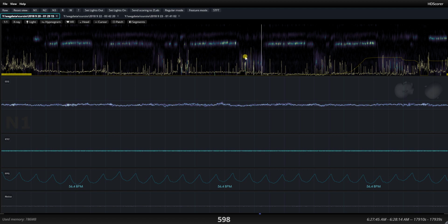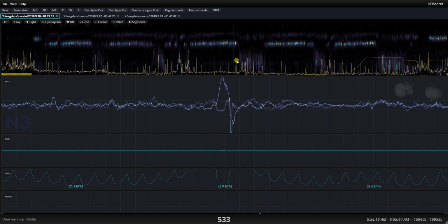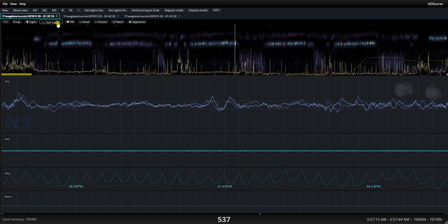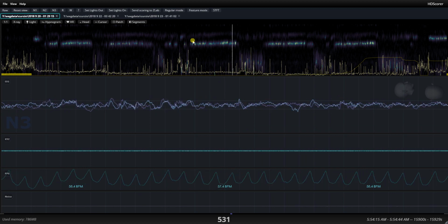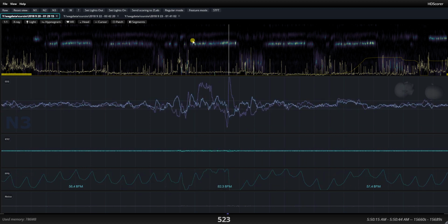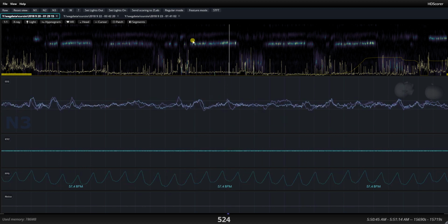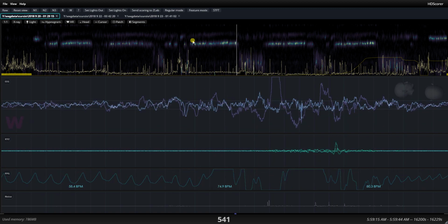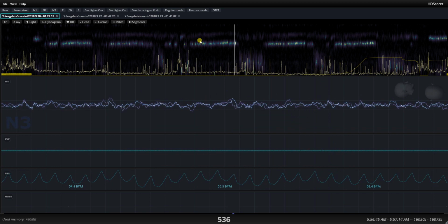There are places like here, for example, this range right here where I'm in deep sleep, I'm in N3 sleep, and still have peaks. So a sleep staging system based only on accelerometry, based only on PPG, like some of these watches, may think that this is REM, whereas in fact it's N3.